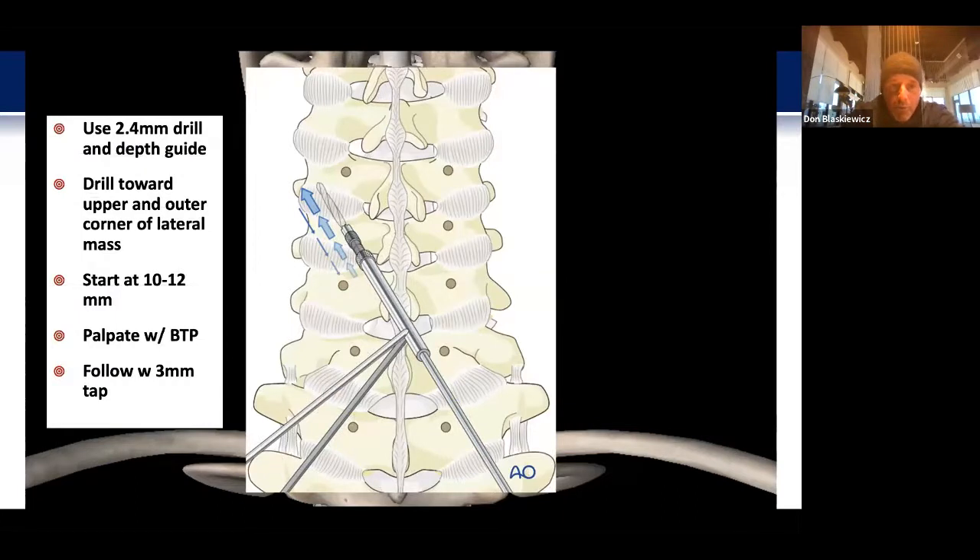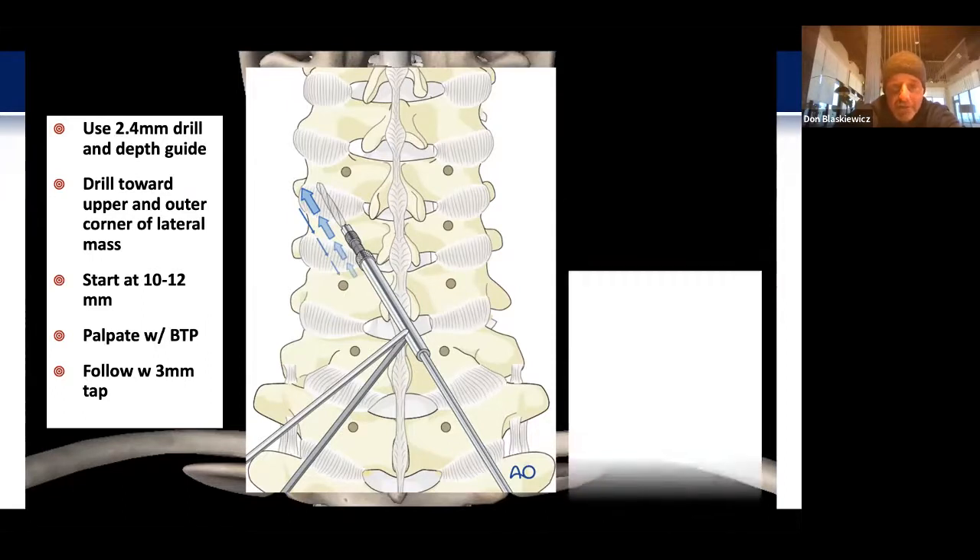Using the 2.4 mm drill and depth guide, I'll drill again towards the upper outer corner of the lateral mass. I generally start at 10 to 12 mm depending on the size and morphology of the patient and their bone. I'll palpate with a ball-tip probe, and occasionally tap beyond that if I want a bicortical purchase, then follow with a 3 mm tap. I like to do all this sharp instrumentation passing prior to removing the lamina in these cases to avoid any inadvertent touching of the cord.